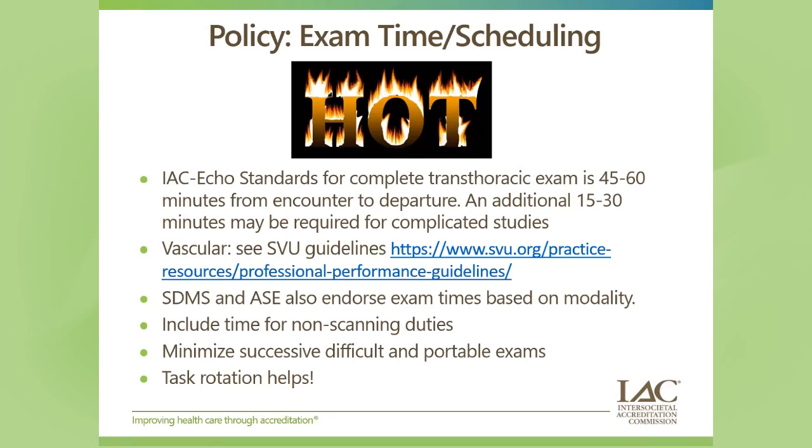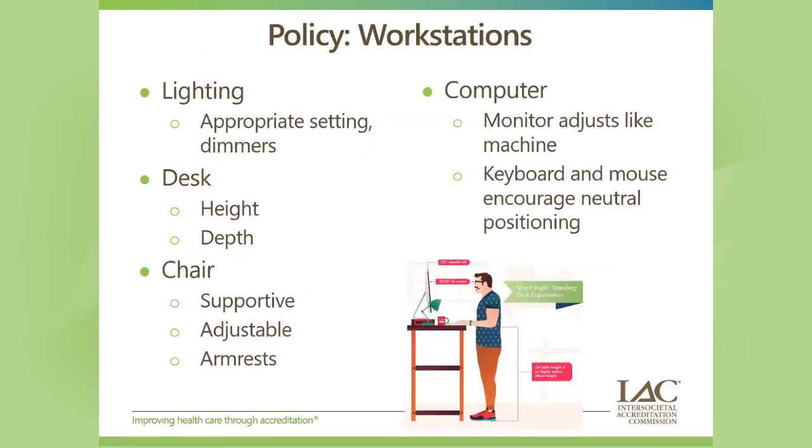And I think as you look through your day, if you're someone that looks ahead at the people coming through that you might be working with for your scans and seeing what you have, maybe it's something where if your templates line up, you're able to talk with your colleague and say, oh, I have this many AS patients in a row. Do you think we could flip-flop one of these patients so we could mix it up a little bit and think about what we have for that work up for pathology as well as the scan time involved? All right, let's move on to workstations.